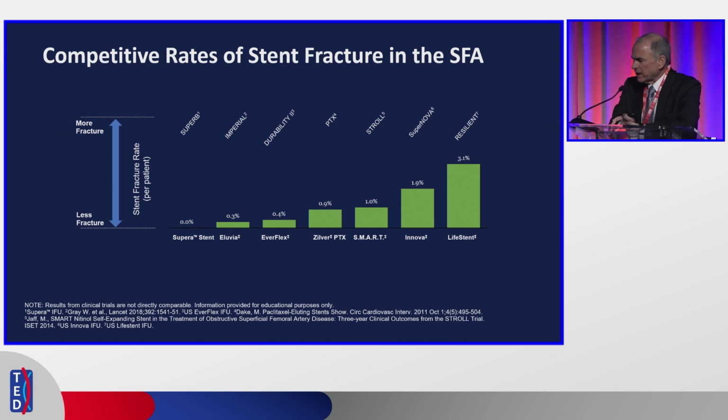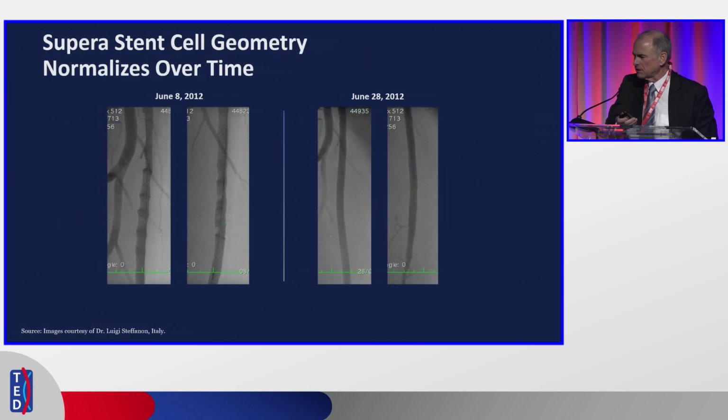Now, what about stent fractures? These simply don't fracture. I have been sent cases where fractures did occur, and I've seen them in 3 cases. 2 of those where people had placed them in popliteal entrapment syndrome and had tried to go in after and open them up with cutting atherectomy, and who knows which caused the fracture. And I saw one other, I don't remember what happened, but there were multiple, again, atherectomies performed, and that was in the whole, people would send me these as they saw them.